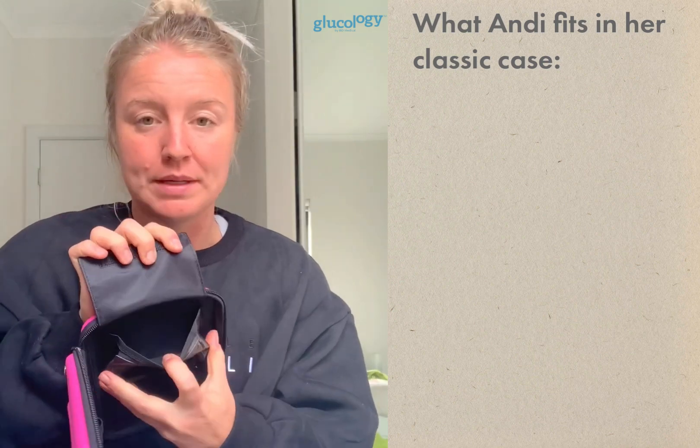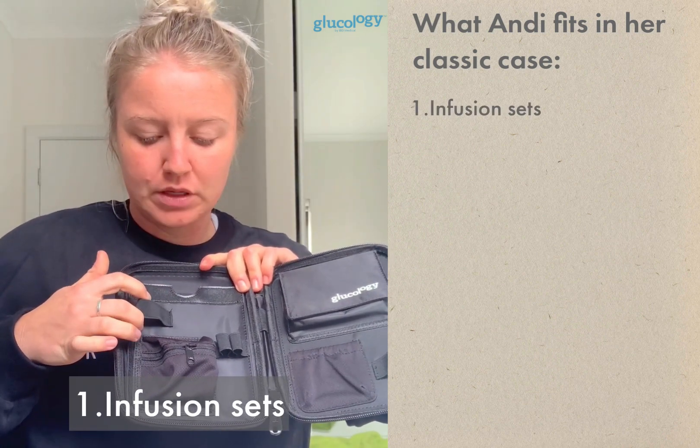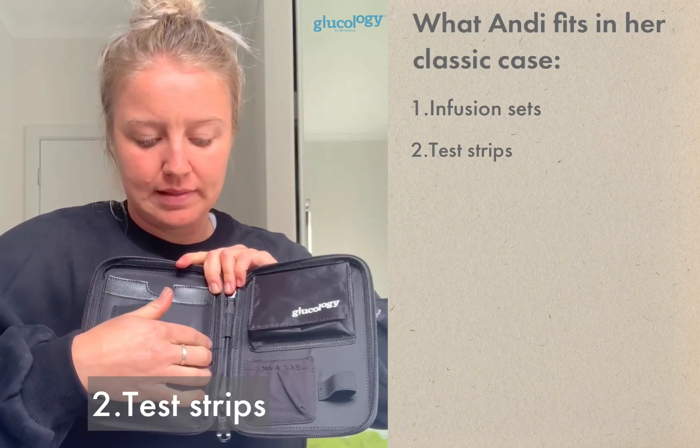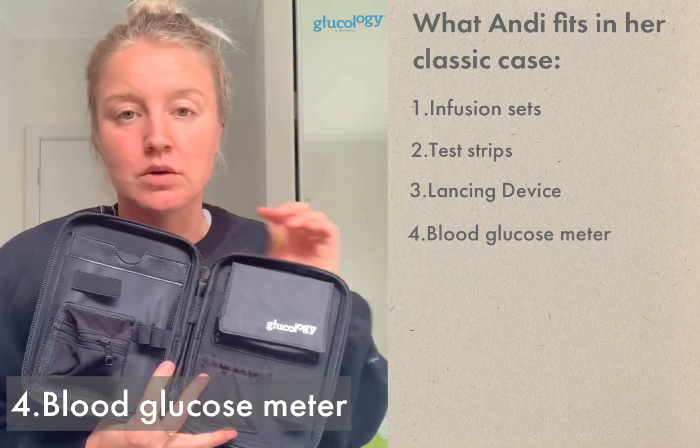When you open up the original smaller case, it's a fantastic size if you're just going out for the day — running errands, coming back home. It has more than enough room for everything you need to manage type 1 daily. There's a fatter velcro pocket for infusion sets, and an area for test strips, a lancing device, and a blood glucose meter.